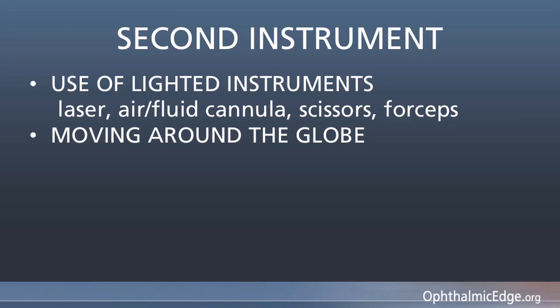Moving around the globe is a little fussy. You must learn to move a lighted instrument before you move your image. If you move your instrument too fast, you'll go outside the view of 120 degrees and lose the position of where your second instrument is. If this happens, it's always easier to pull out and start over with proper positioning and movement. Once you learn this technique, it becomes pretty easy to move around the globe, moving the lighted instrument first from one side to another of your image, and then moving your scope in stepwise fashion around the globe.